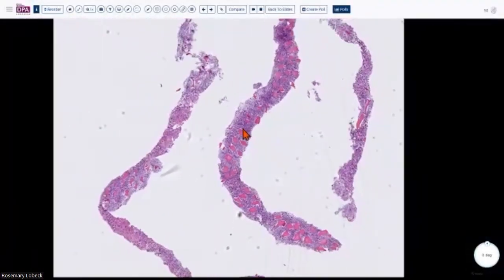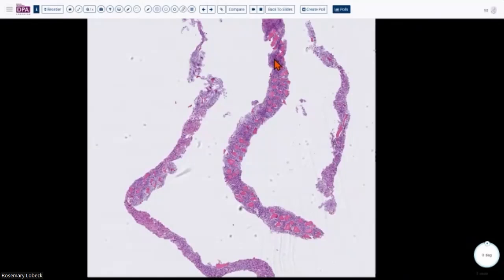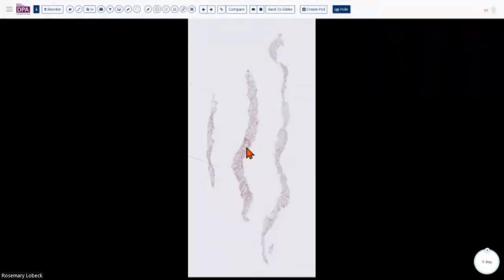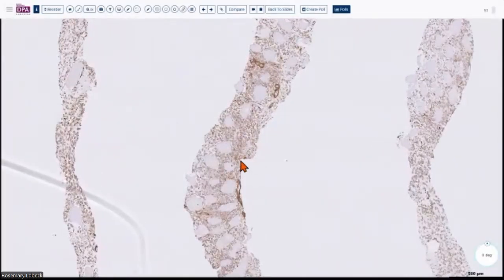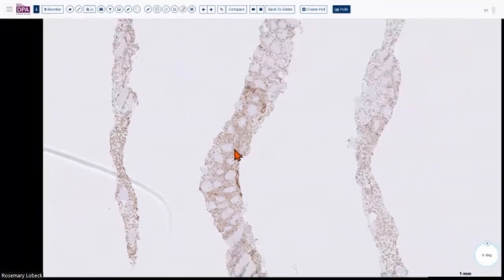So if you pull back, you will see that the soft tissue proliferation seems to be respecting the muscle bundles, right? So it's not really pulling things apart and then destroying everything. It's kind of softly insinuating in between the muscle bundles. So that's kind of a clue. So SMA was done in this case, and it's diffusely strongly positive. It just proves to you that this is a myofibroblastic proliferation. So this happens to be a case of proliferative myositis that mimics a sarcoma.